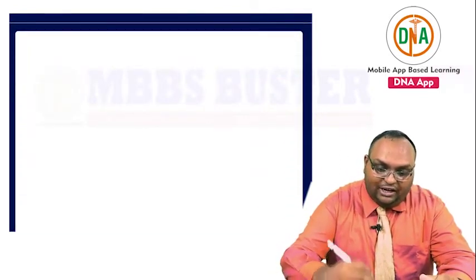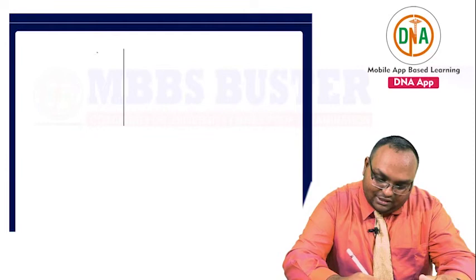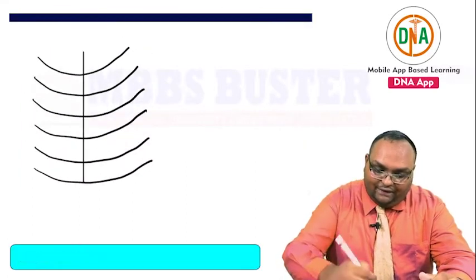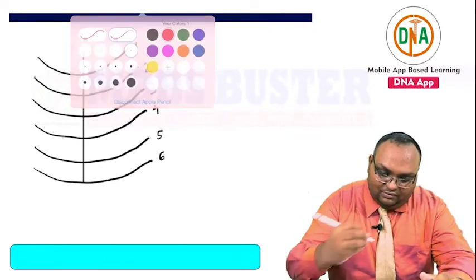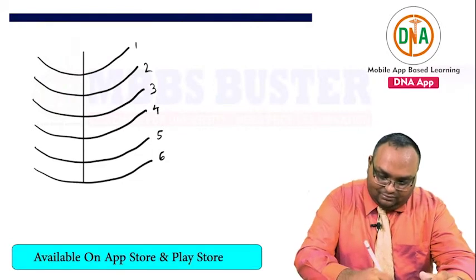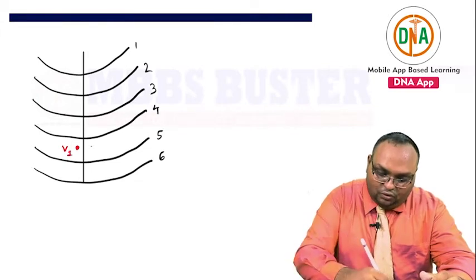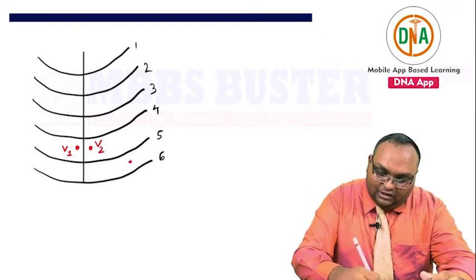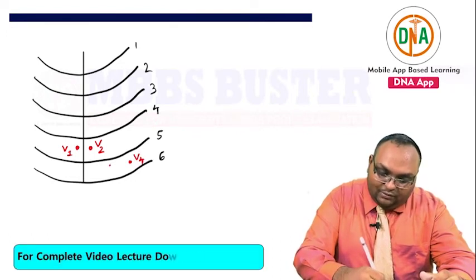Just to give you a preliminary idea about the lead placements of the chest electrodes, if you consider this to be the sternum diagrammatically and you consider these to be the ribs on the anterior chest wall of a person and you number them, you know that the lead V1 will be placed on the right side parasternally in the fourth intercostal space, V2 on the left side parasternally in the fourth intercostal space, the lead V4 along the left midclavicular line in the left fifth intercostal space, the lead V3 in between V2 and V4.